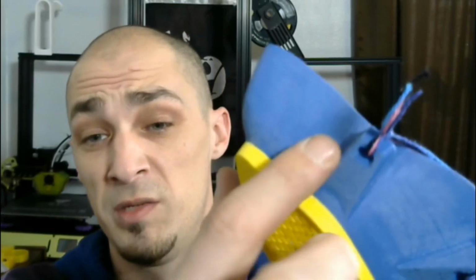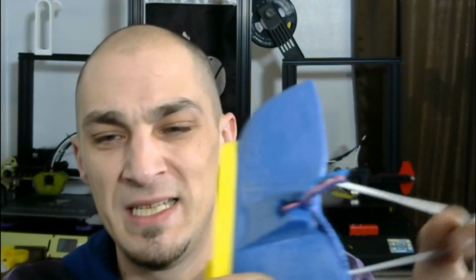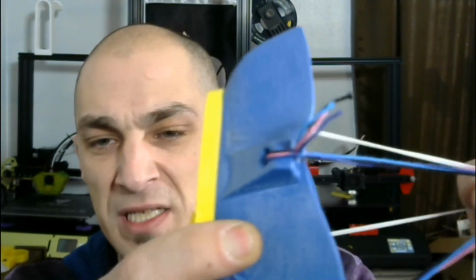Now, a lot of this model has been sanded really smooth and is ready to be sealed, but I do still have some sanding to do down in the bottom corners here and at some of the seams. So plenty of work left to do. Like I said, the elastic bands need to be replaced and fitted on the other side, and there is always the option of form fitting this to your face.